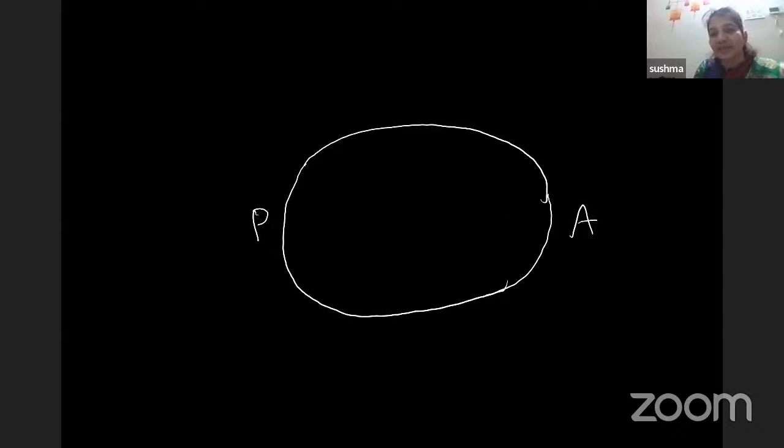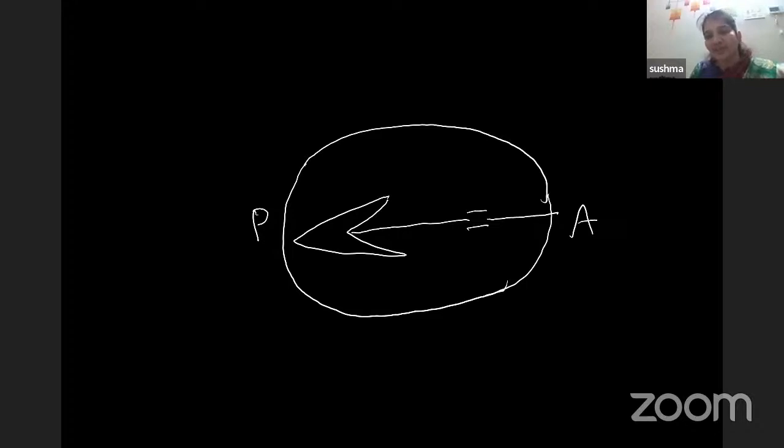We should see a midline falx, which is interrupted between anterior 1/3 and posterior 2/3 by cavum septum pellucidum, which is a rectangular box-like structure. And here we have an arrow sign. This is how you have to recognize transthalamic plane or BPD plane. So most of us are familiar with this plane. So having this plane as a base plane, we will move forward to learn transventricular plane and transcerebellar planes.